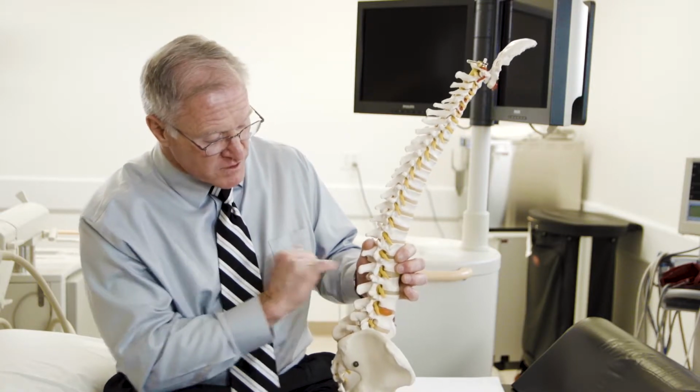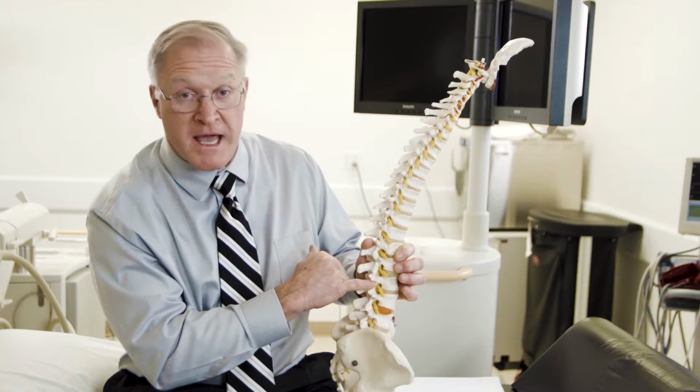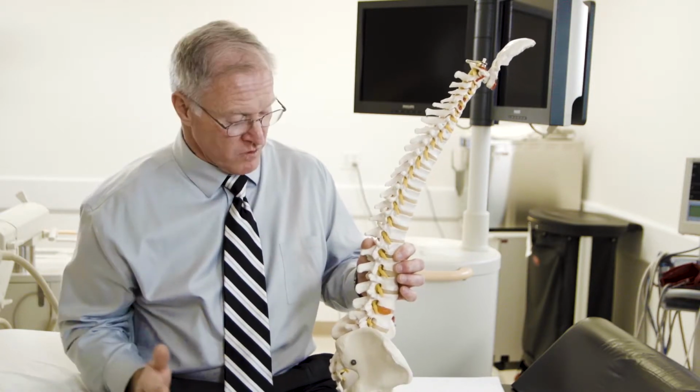So for instance, if I was treating this root here, I would slowly guide that needle towards that little space, and as I slowly enter the actual foramen, the hole where the nerve root exits, you'll start to feel something either down the front or side or back of your leg. At that point in time, I stop immediately, and then I inject a small amount of contrast, which is a liquid that shows up on x-ray.